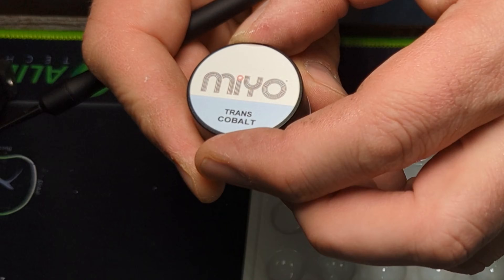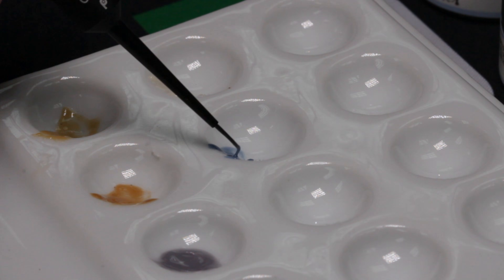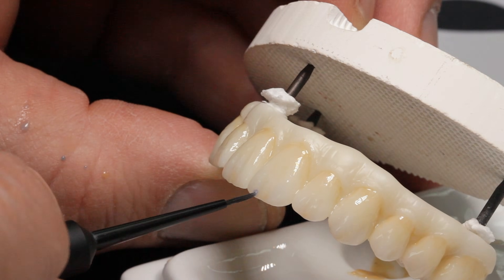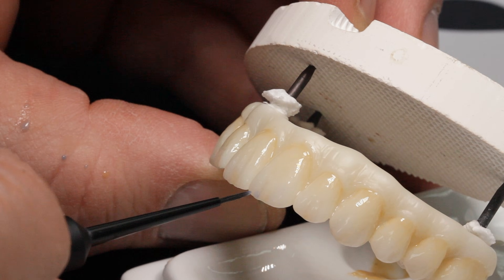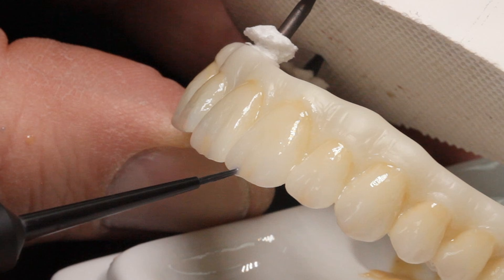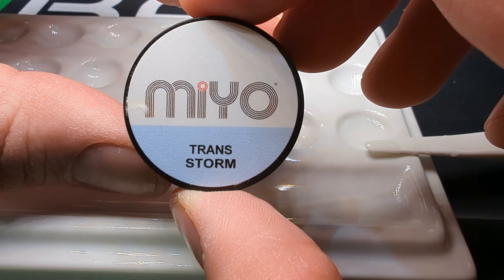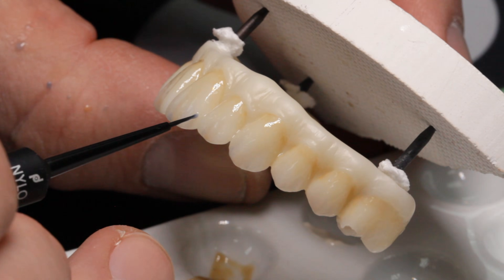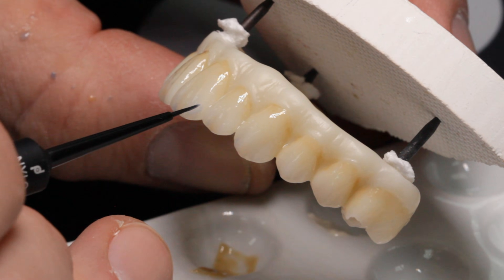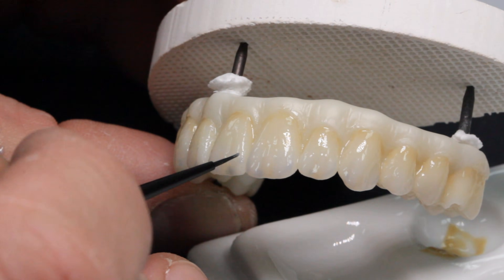Cobalt is a dark gray-blue and I love it for small, highly translucent clear accents — imagine layering clear porcelain, and Cobalt gives you that same effect. Be careful, it is a very intense color and should be used only in small areas. Storm, on the other hand, is a more subtle blue — a little more intense than Smoke but not as intense as Cobalt. I use Storm for translucent areas at the mesial and distal incisal areas.